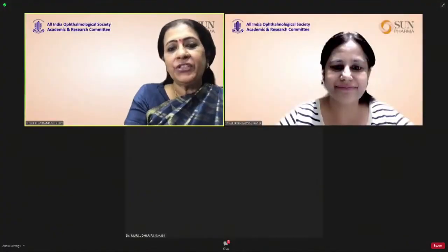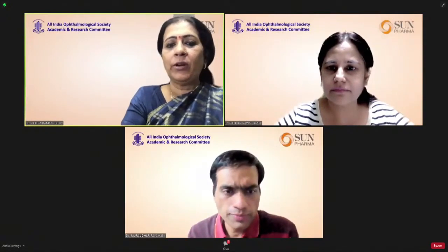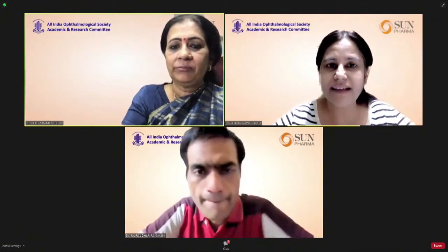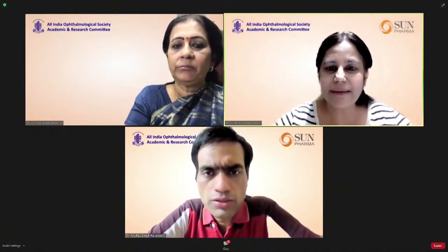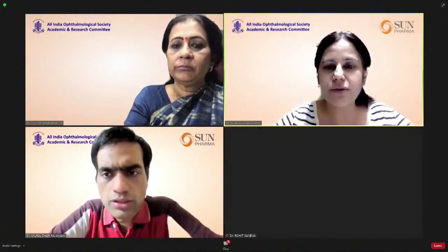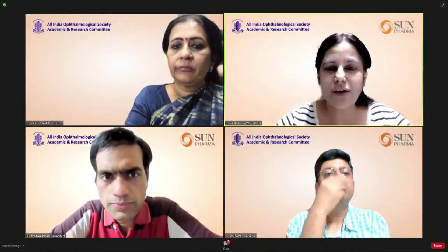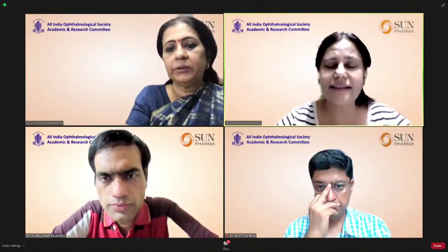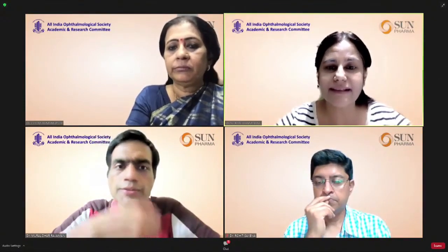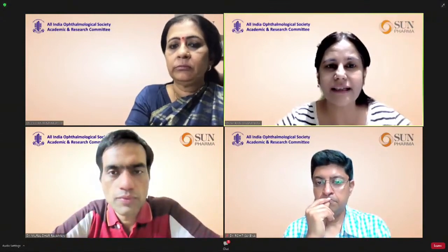Can there be a selective GCC loss or RNFL loss, one or the other not happening? It all depends on the timing. As I said before, it takes around 4 weeks for RNFL loss to appear. In ischemic optic neuropathies, the GCC loss is very immediate. It occurs very fast.